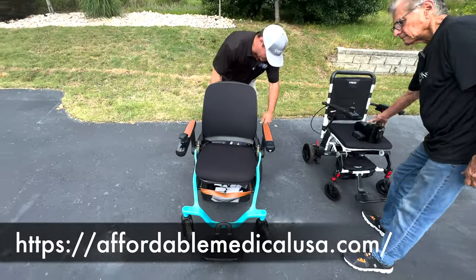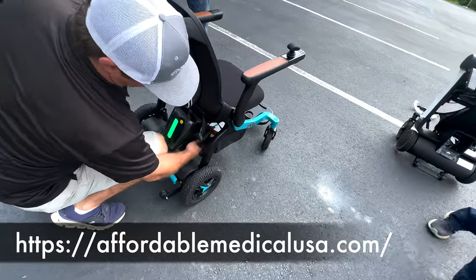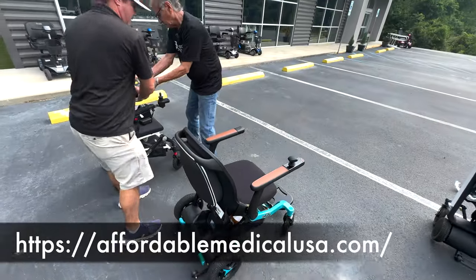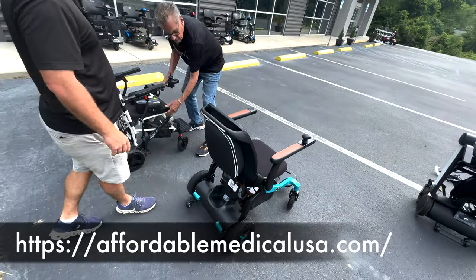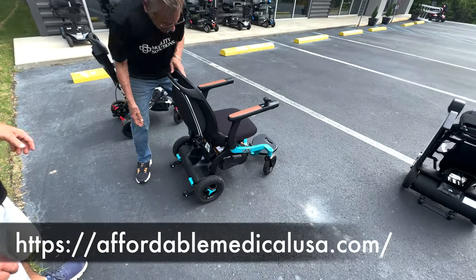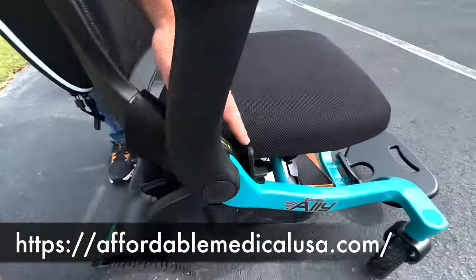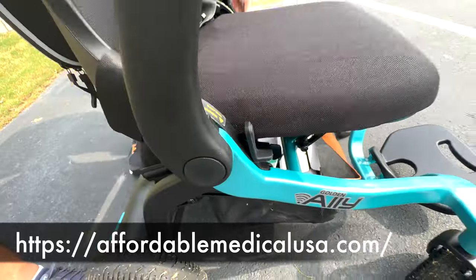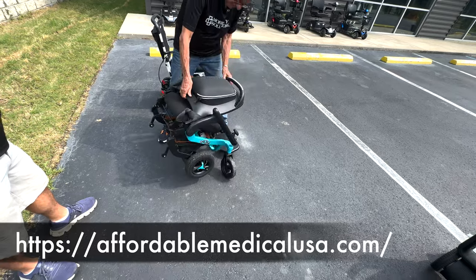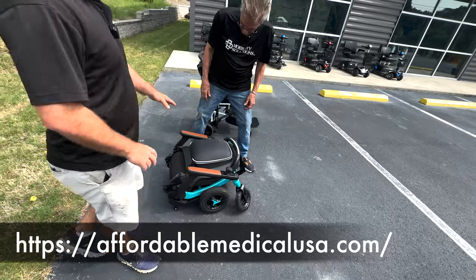Allie, we're going to take the battery out. And to take the battery that's on both sides, you got to go to unlock, clip it, bring it out. Just put it right there. Fold this bad boy up. Remember the hand thing. You already forgot. Hold on. No, remember, it's right here. On both sides, there's a lever. You don't have to use both, one or the other. Yeah, that was easy. Make sure it locks. It's locked.